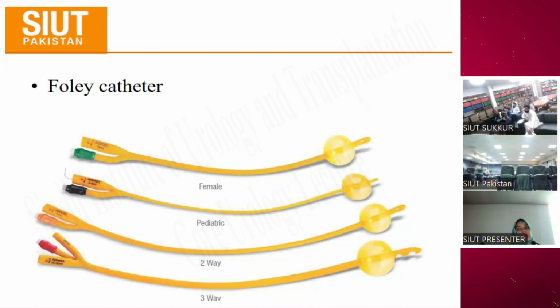Yes, when there is bleeding, we can use this balloon Foley's catheter to give a tamponade effect, as we don't have other catheters or other PCN available, so we place a Foley's catheter. What other indication? When there is pus, we also use a Foley's catheter as PCN, when we are doing pyelolithotomy and there is pus in the system, so we place it.